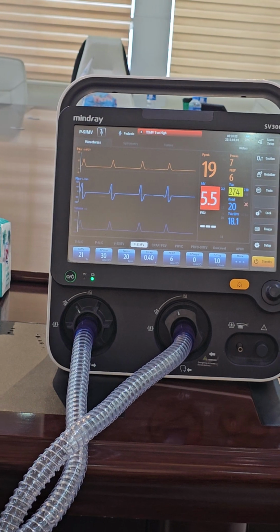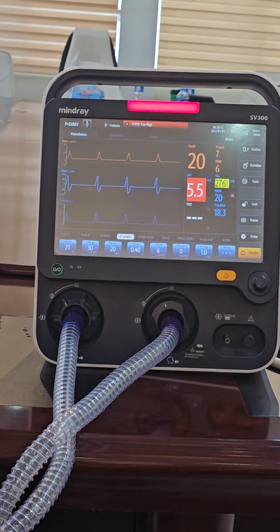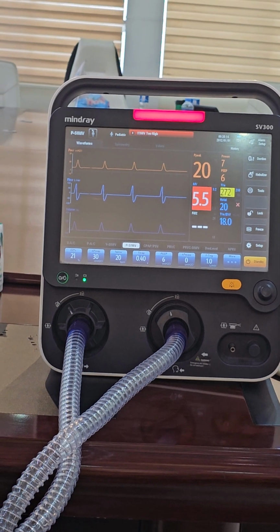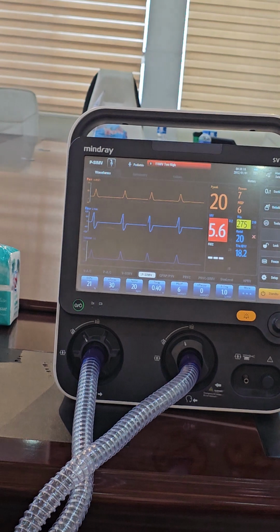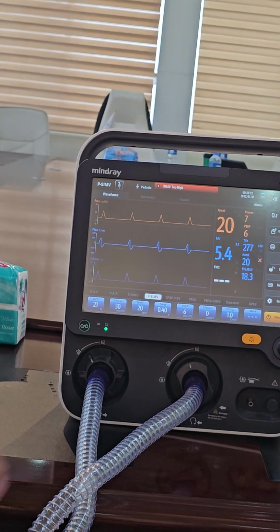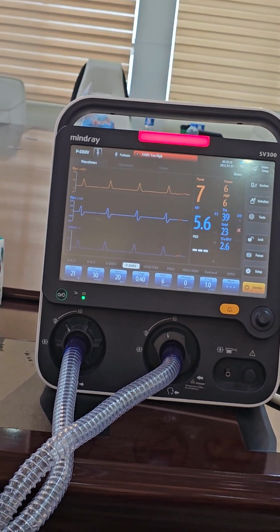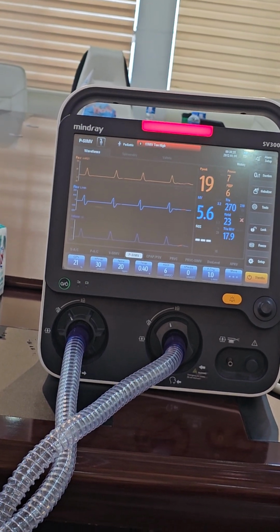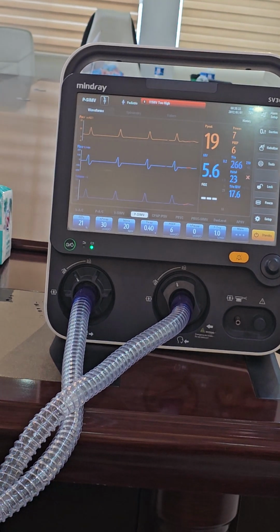That's why when the patient has low CO2 and he's on AC, I'll tell you, move him to SIMV. Let's say the patient is breathing 60 breaths per minute and the rate is 30. In AC, what will the measured rate be? The patient is breathing 60, the ventilator is 30, and we are on assisted control.